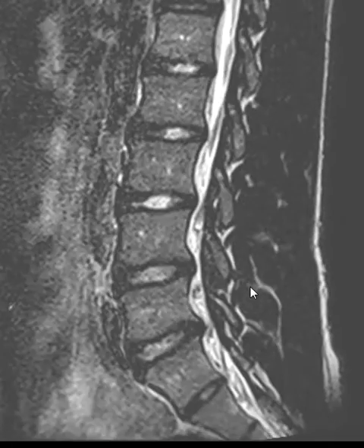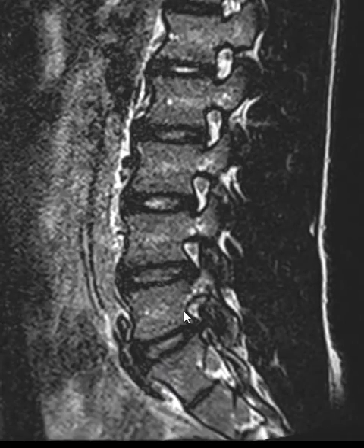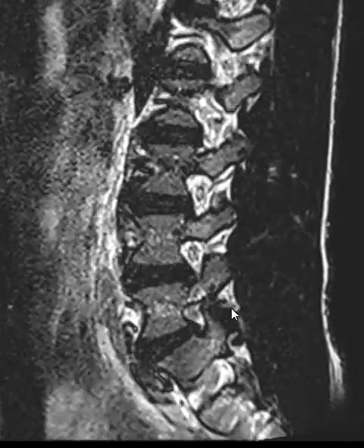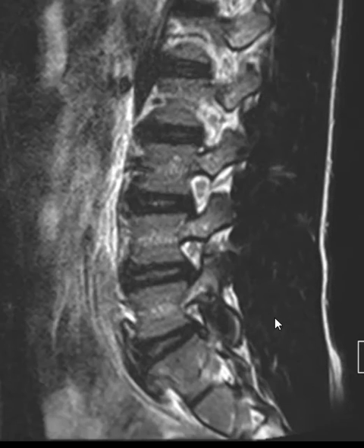On these really thin T2-weighted sequences, we look over here and we can see a little vertical fracture line right here. So there's a little stress fracture in the left pedicle and the surrounding marrow edema. These things can be really hard to see, so you really have to look for them to appreciate them sometimes.